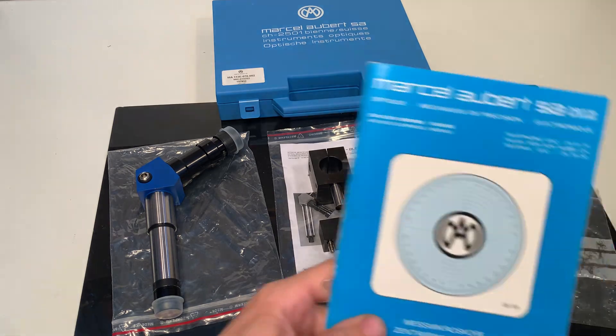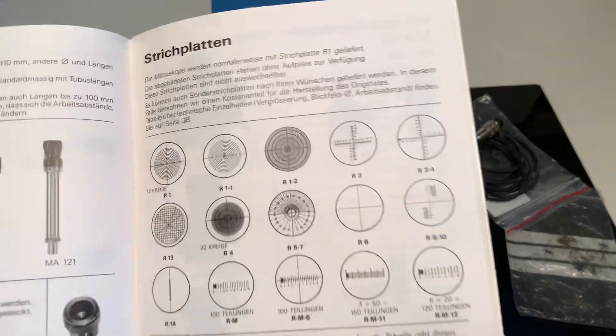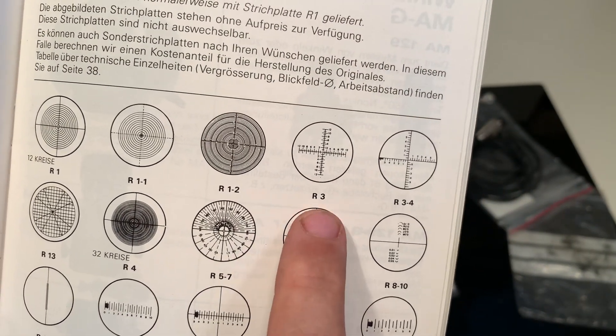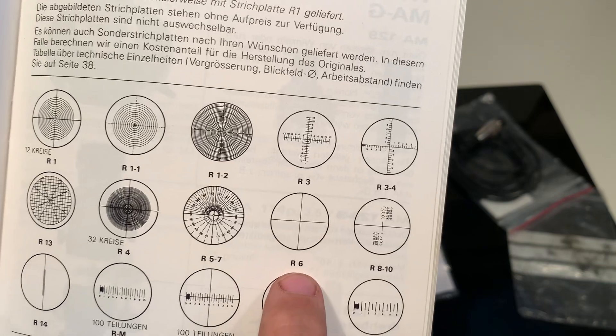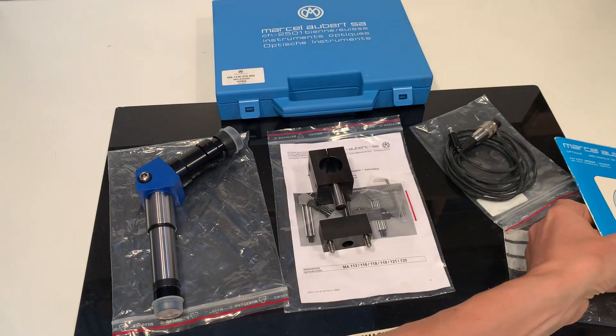I have a catalog here. It comes out of my own collection and does not belong to the sale. But I can show — so this is the crosshair, the R6, included.